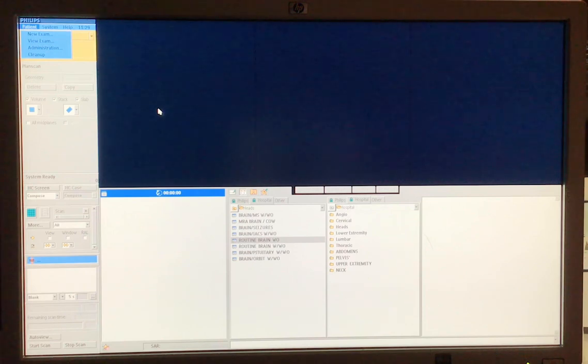And what you will want to recognize is there is an MRI Brain without. If we flip it over, this is the MRI Brain with and without for MS. So depending on whatever order you pick is dependent on which protocol that you're going to use.